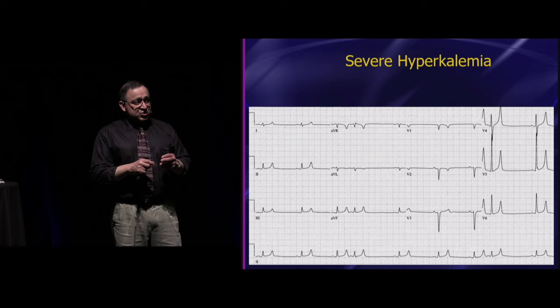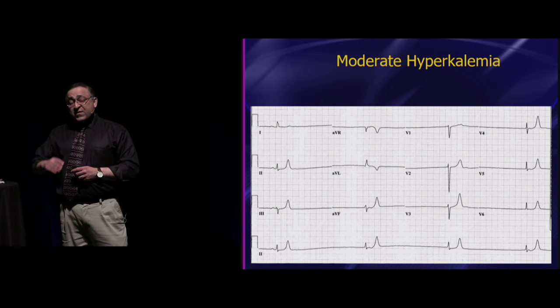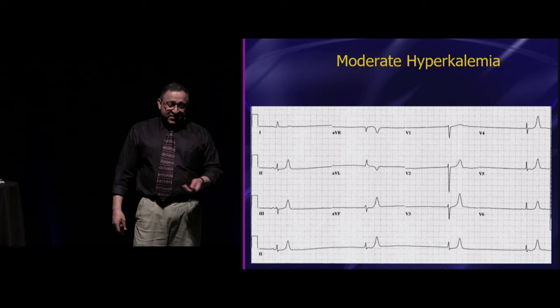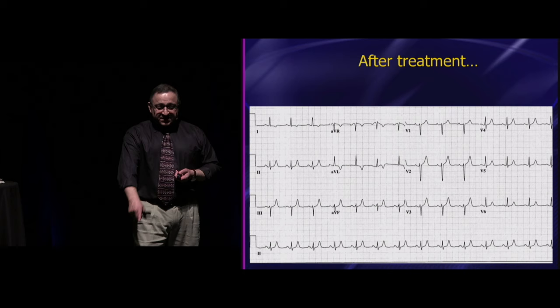So here's another one. This is the highest potassium level I've ever taken care of in a person who survived with a good outcome, 10.2. Take a look at the rate here. I don't even know what the rate is. It's not even worth counting, right? And then there's some peaking of the T waves out here. This is classic hyper-K. Nobody teaches the bradycardia.